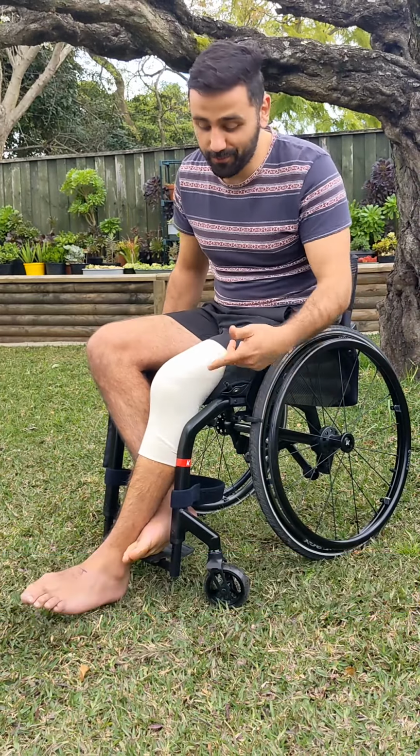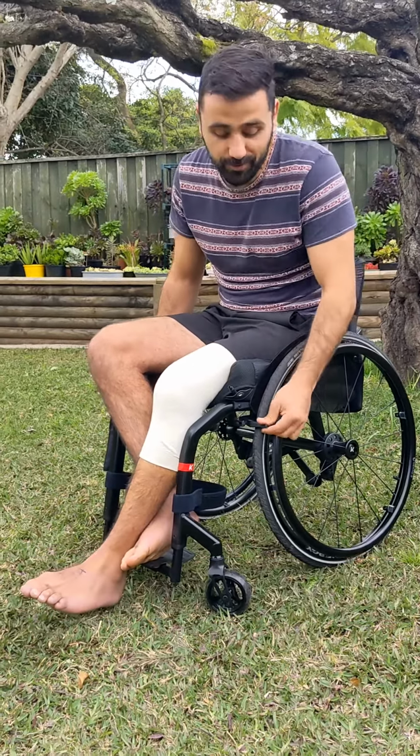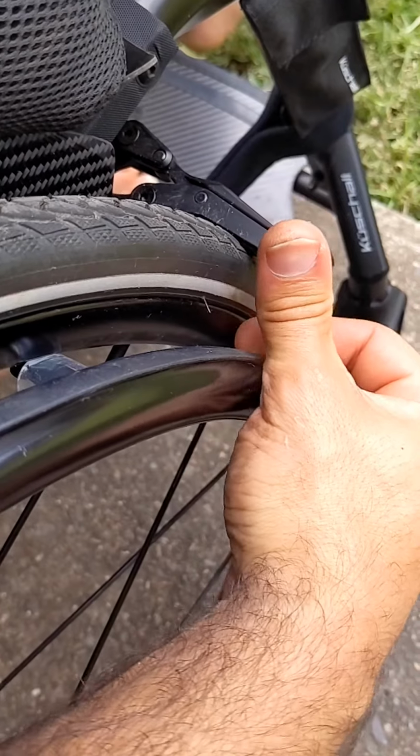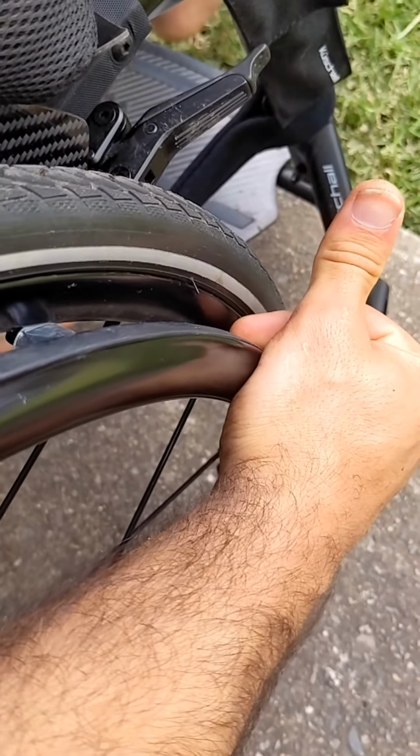When I pulled up here for using this wheelchair for my knee, my mum tried to take these off and she screamed at these things because she just could not get them off. And that is because if you're standing, it is really hard to get that line and pull correct.